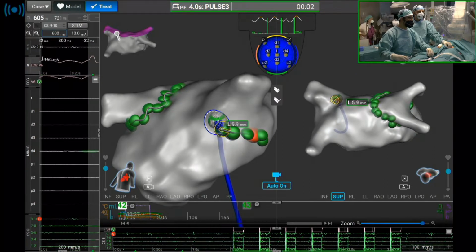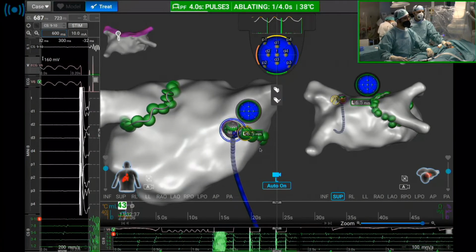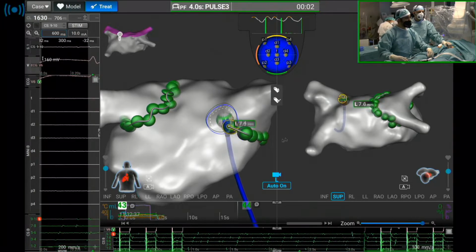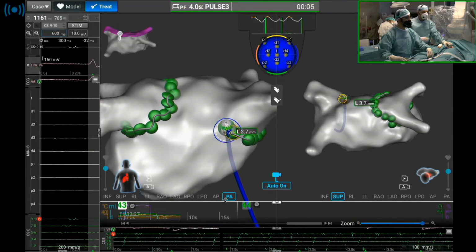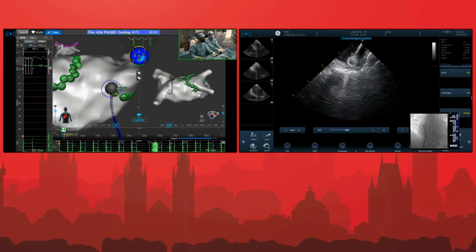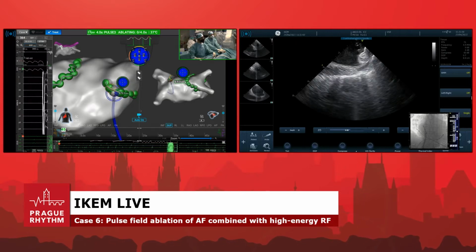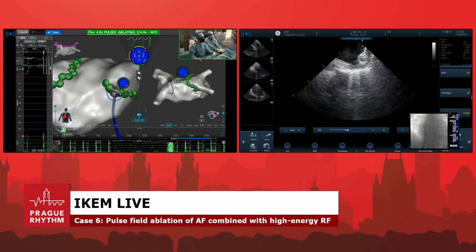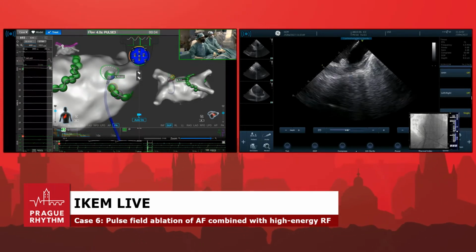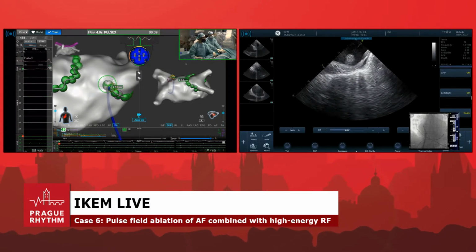But on the posterior wall, as I will show in my lecture, use only PF. First pulse, eliminate potential. If you go to the next spot, no potential, right? So therefore, we're not doing the electrogram-guided ablation, just connecting. Okay. That's only for communication. So you see what's going on? Ablate, eliminate potential very nicely. If you go to the next spot, we never ablated, already potentials disappeared. But still, we need to connect the region.